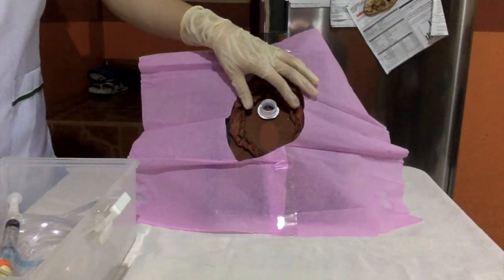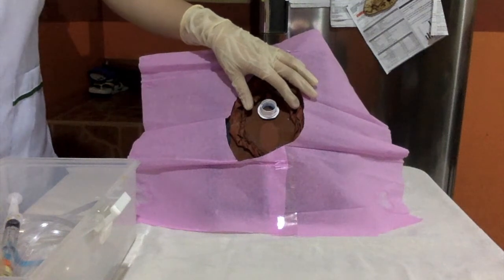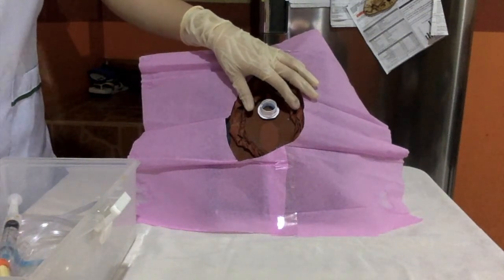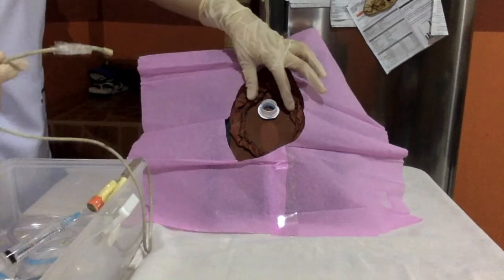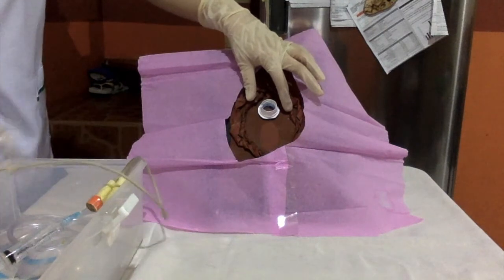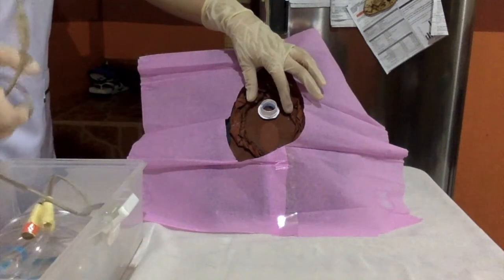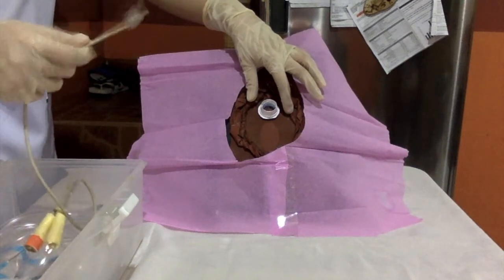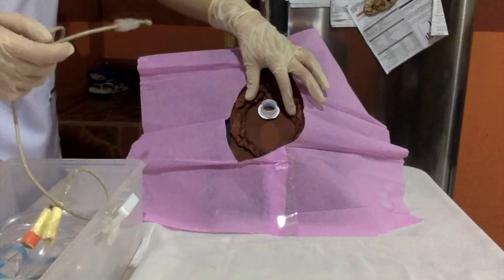So with the use of my dominant hand, which is also considered the sterile hand, I will grasp or pick the catheter up about 1.5 to 2 inches from the tip. I will gather additional tubing in my hand so that I could have full control over the catheter length. And I will also encourage my patient to bear down and breathe deeply.